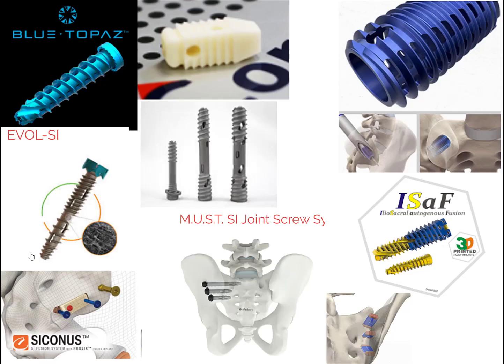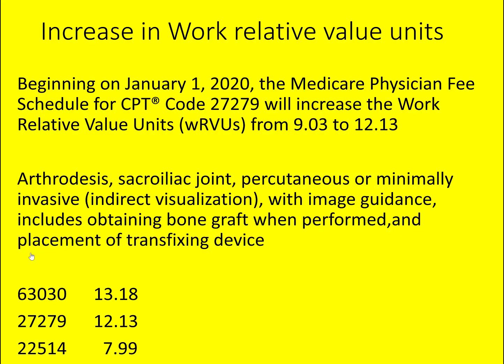So I looked up SI joint fusions. There's I think 19 on the market now, and these are like, I don't know, 10 of them. And they don't even have the most common one now, the one that started the whole thing. I'm going to show the most common one, but they're very variable. Sometimes they're just basically hollow implants with bone in the middle that you expect to fuse through those holes. Some of them are allograft. The bottom left is sort of like the Smith-Peterson technique, and some of them are hydroxyapatite that fused.